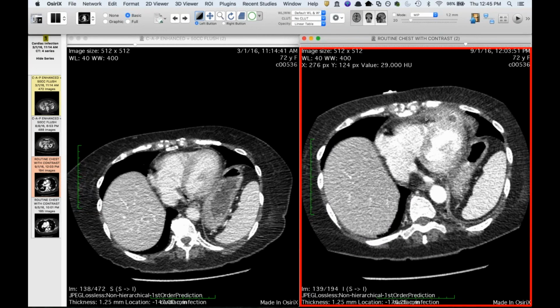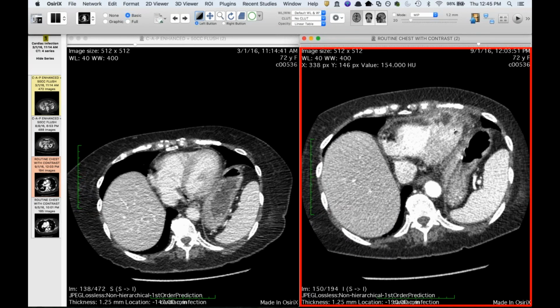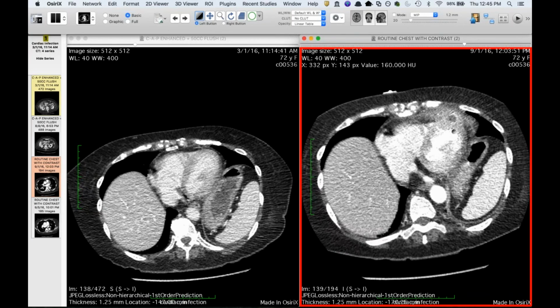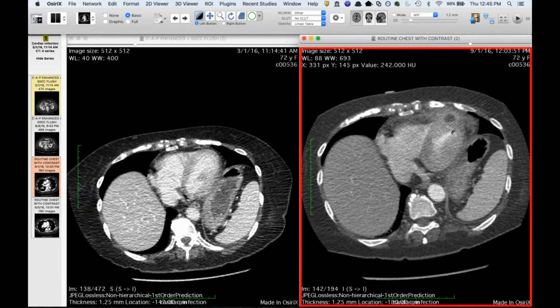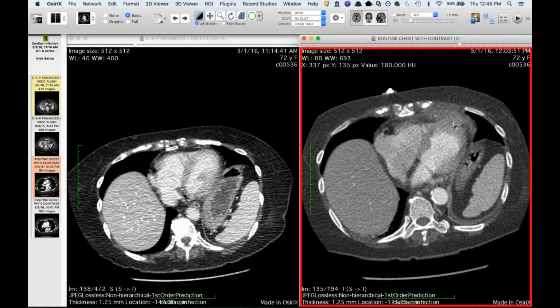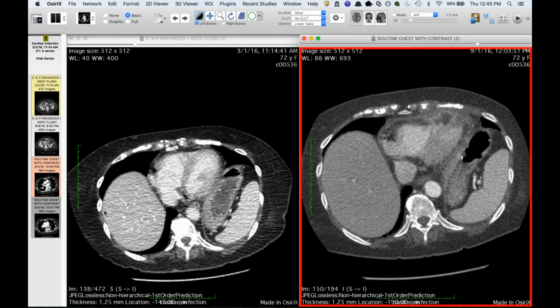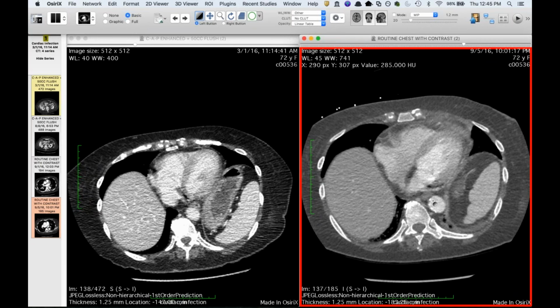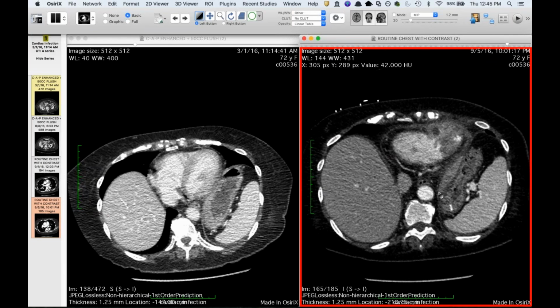you can see she's got a lot of pericardial thickening and inflammation, and she also has this loculated rim-enhancing fluid collection, and it's hard to precisely localize it because you wonder if it's involving the wall of the left ventricle as well as the pericardial space. It certainly looks like it's centered in the pericardial space, but she was bacteremic, and I don't remember what it was, but she was also DNR-DNI by this point, and you can see over the course of a few days that this enlarged in size, which is kind of interesting.